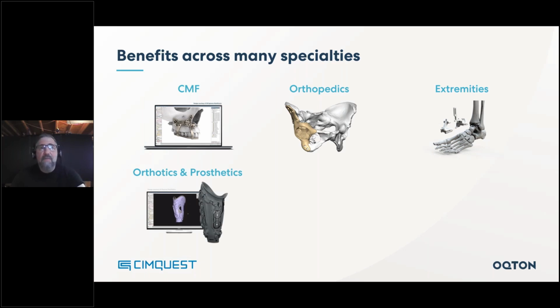O&P is a market where we're having a lot of success because O&P specialists really take to the unique user experience and the haptic interaction, which allow traditional craftspeople to translate techniques used in the physical space to the digital design space. And honestly, if you're used to working in the hand-built, bespoke world, wouldn't you like to have an undo button for creating an object?